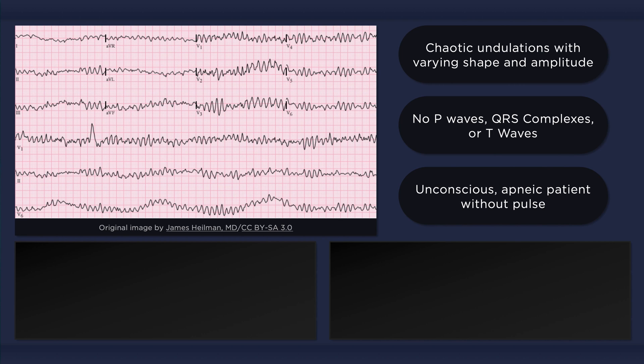V-fib is one of the most common dysrhythmias that can cause cardiac arrest. Instead of the heart contracting in a coordinated manner, it just quivers and twitches. Circulation ceases, and within seconds there is loss of consciousness and apnea. This is a very important rhythm to recognize because it requires immediate action — it will deteriorate to asystole and death if not treated rapidly.